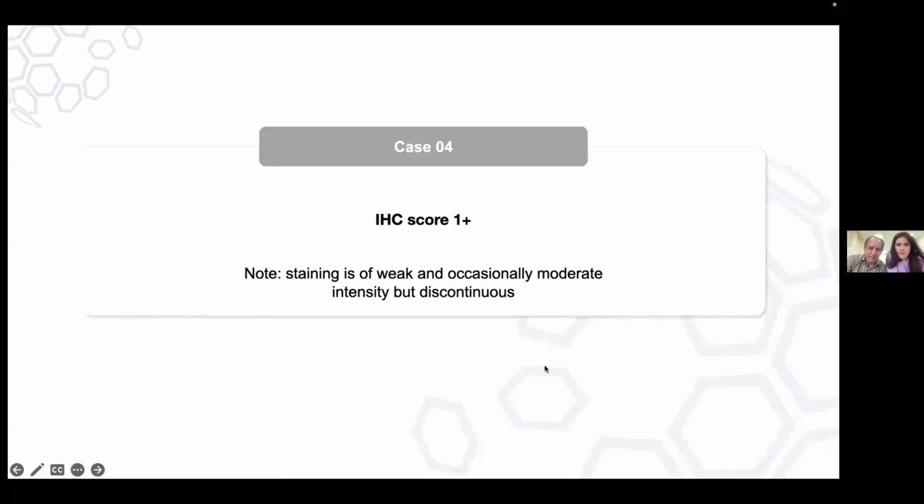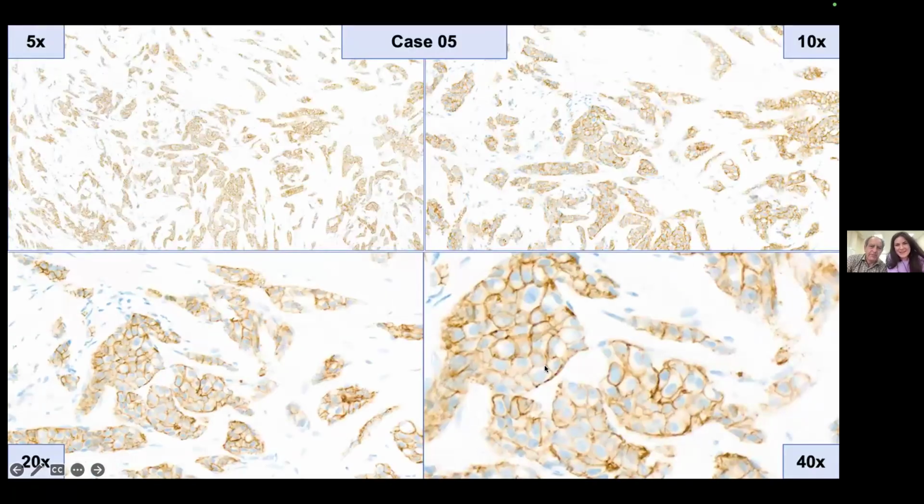Okay, but this is an easy case. Let me find another one. This is a nice case. I don't know if it's a nice case. Okay, what do you guys think of that? Let's see what you think of that. A different case. This is really good because everybody has logged into the fact that this is either 3+ or 2+. There is very little hesitation on this. We can share results.